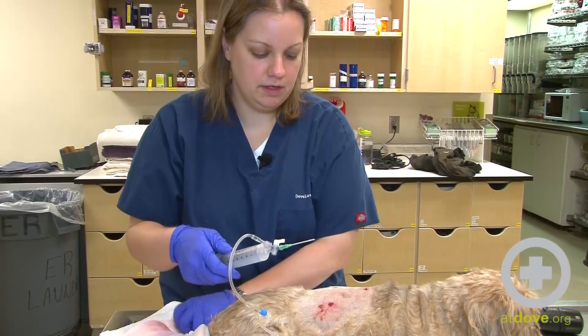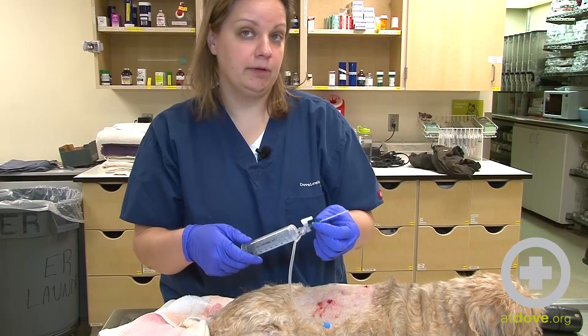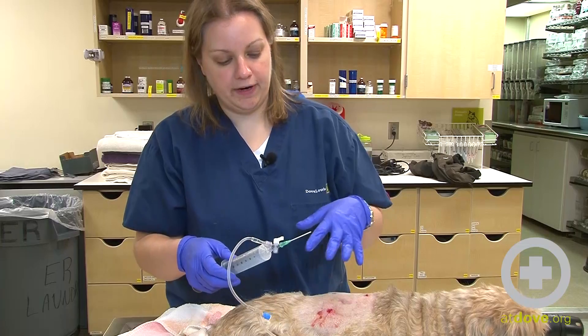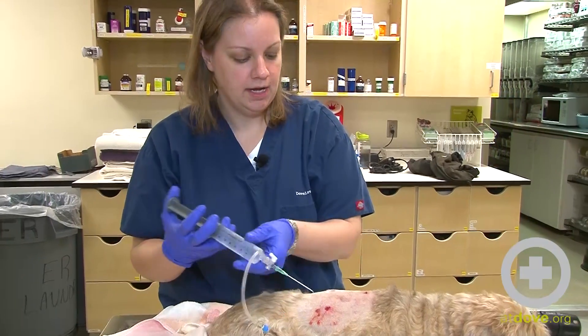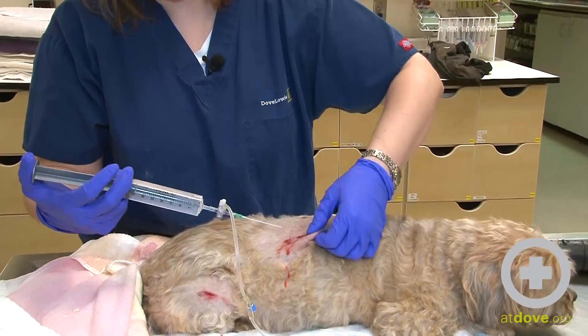For flushing wounds, the best setup to use is a 35 mil syringe and an 18 gauge — here we like to use a catheter, though you can also use a needle. That's going to provide the best PSI for cleaning out a wound, and this is hooked up to a bag of saline. You can also use LRS.